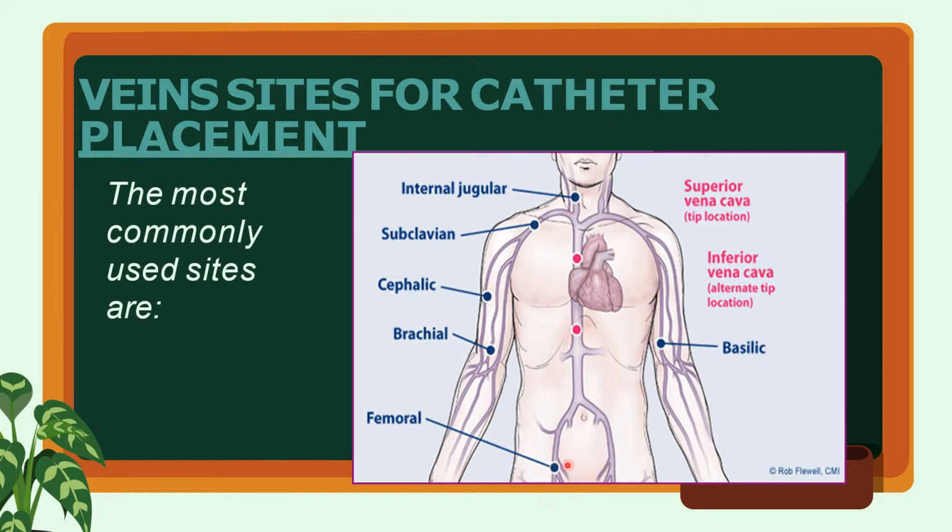And the catheter should be tunneled to reduce the risk for infection. When the expected duration of catheter use is less than 5 to 7 days, the risk for infection is limited, and the jugular approach is therefore preferable, given its lower associated risk for life-threatening mechanical complications.